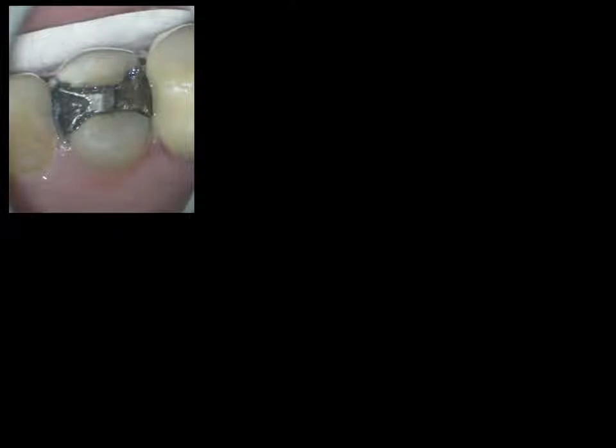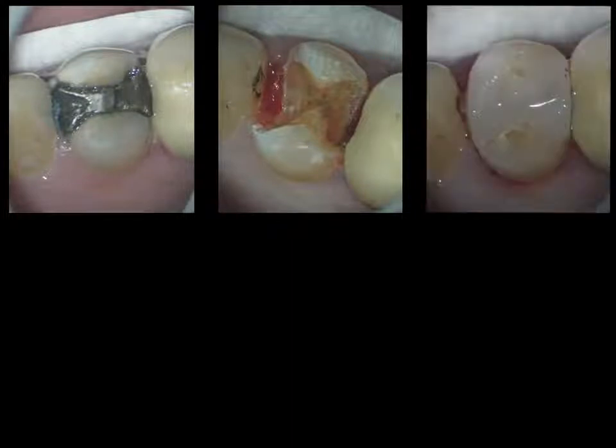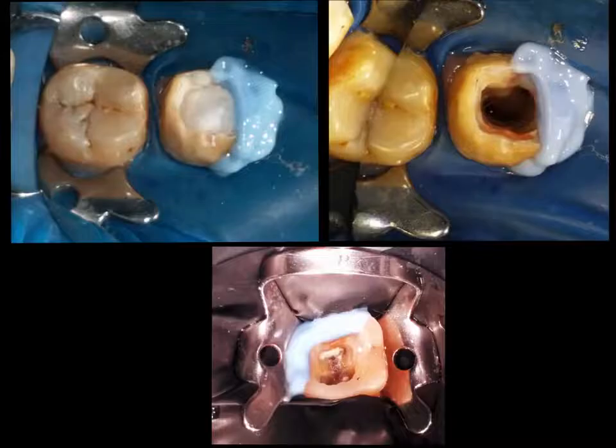For example, we have a tooth here which has a cracked amalgam filling. Removal of the amalgam filling exposes the entire tooth, but here we have not exposed the pulp intentionally, so that we can go ahead and restore the tooth with a contrast-colored composite, isolate the tooth, and then start from the center. That gives us centrality as well as a reservoir for the hypochlorite, preventing leaching to proximal spaces.